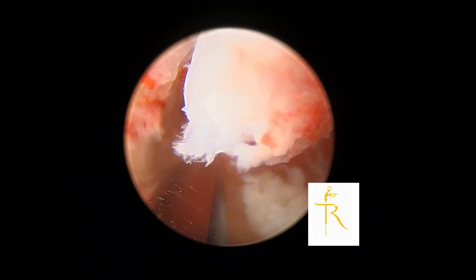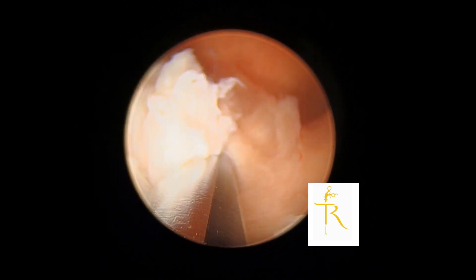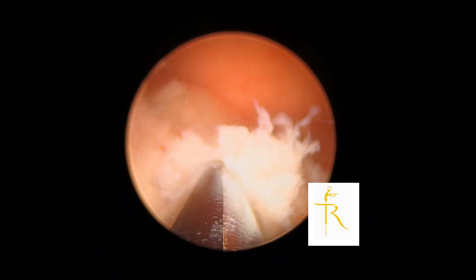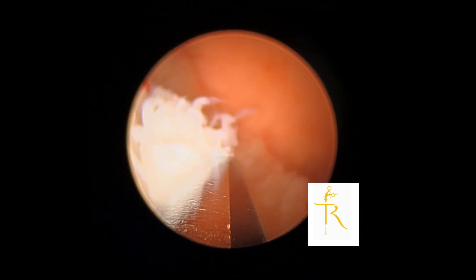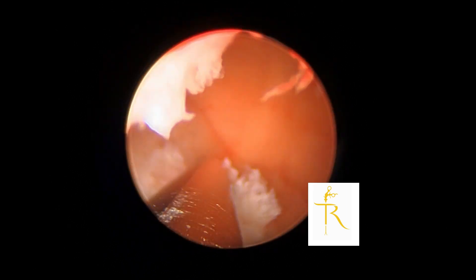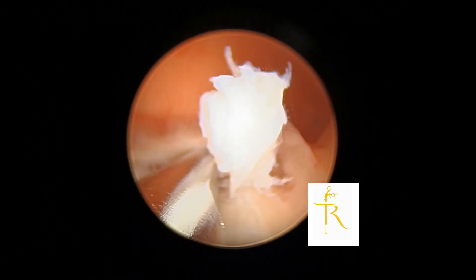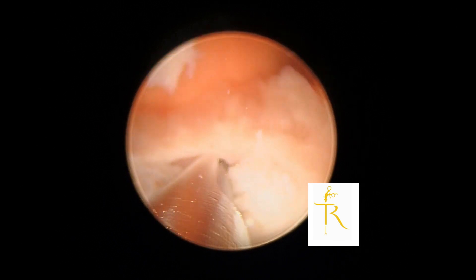Those of you who've played Pac-Man can remember that yellow round thing with a really wide mouth — this mechanical morcellator reminds me of the same. The linear black marking corresponds to the opposite side of the mouth, the place where it actually morcelates. You should be visualizing the black mark, which ensures the morcellating part of the hysteroscope is facing the fibroid.